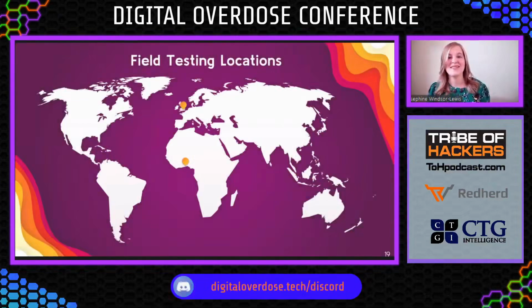Let's talk about the testing we're doing currently. We are testing in two locations. We have tests ongoing in the UK, that's in UCLH, and tests going on in Accra in Ghana. These tests are currently taking place in hospitals because we need to be able to compare the results that we're getting to blood tests. That's the gold standard I mentioned earlier, to see how accurately we are able to predict the bilirubin levels in blood.